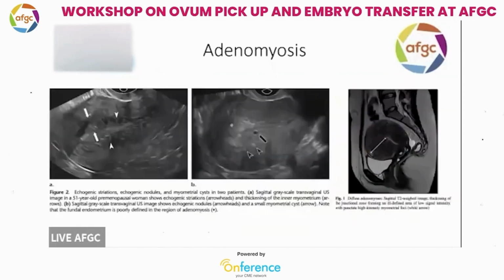So younger patients do well, understandably, but older patients, their prognosis, especially with dwindling egg reserve and poor implantation because of adenomyoma, is less. So 2D actually, you will have to do multiple scans to get a good idea, grasp over 2D scanning, because the clarity comes with doing multiple scans. And when you add 3D and color, as you will see in our consequent lectures, the clarity becomes better.